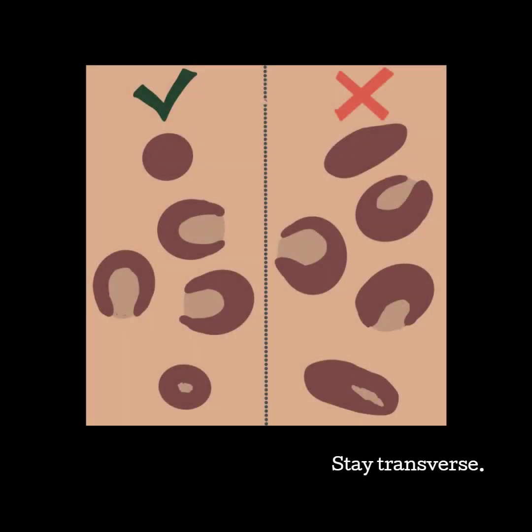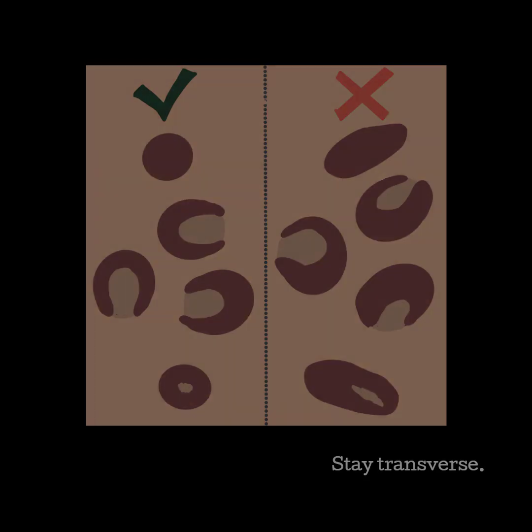Lastly, remember that the kidneys sit at a slight angle in the body. So when a lot of people turn transverse, they just image straight down, forgetting to follow the angle of the kidney. If you do not follow the angle of the kidney, you will start to become oblique on the kidney, changing the appearance. Make sure to keep the poles rounded and watch for your mid portion to have even amounts of kidney around the hilum.